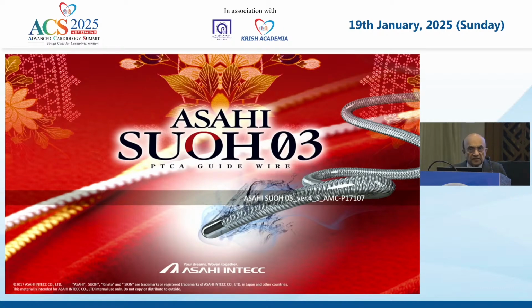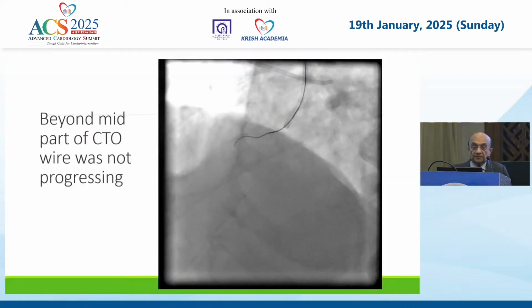Recently, one more wire has come. That is called the Suoh wire. Suoh wire's tip load is very, very low, 0.3 grams only. And this wire is specifically used for entering the septal channels for retrograde CTO procedure.